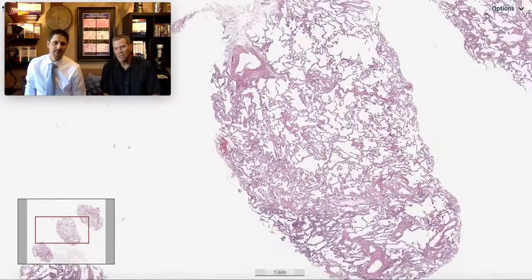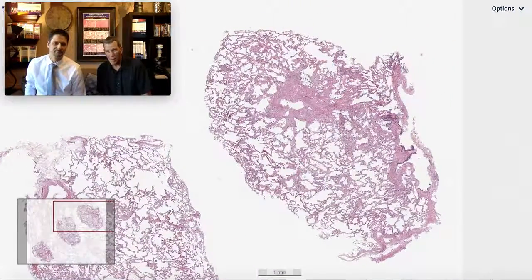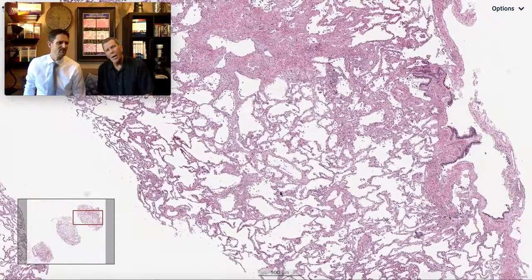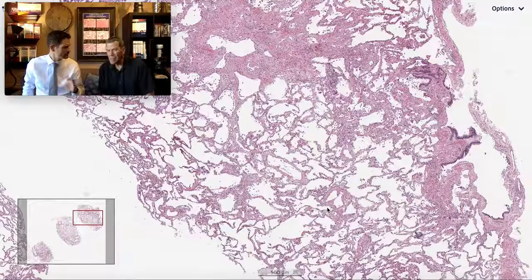This biopsy doesn't have a whole lot to my eye at low magnification. There's an artery there that looks a little prominent. But what about here? You get this very subtle change to the interstitium — interstitial fibrosis — and it's kind of diffuse.